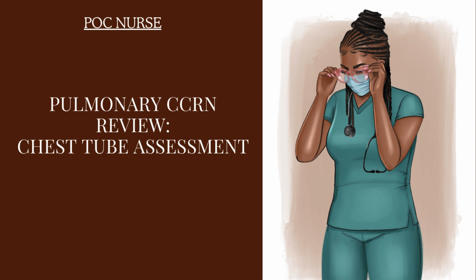If the tubing is kinked inside of the patient, there will be no tidaling. And if it's a new tube that was just placed, that is very concerning because it should be tidaling. It was just placed just now. And if it's not tidaling, it means there is a kink somewhere. If you can't see the kink, that kink might be inside the patient.